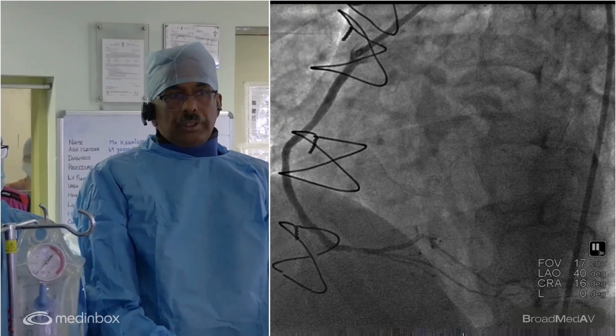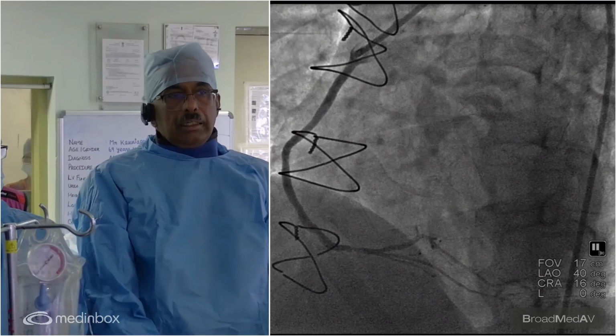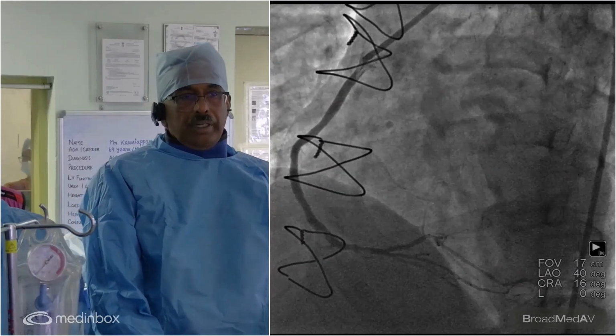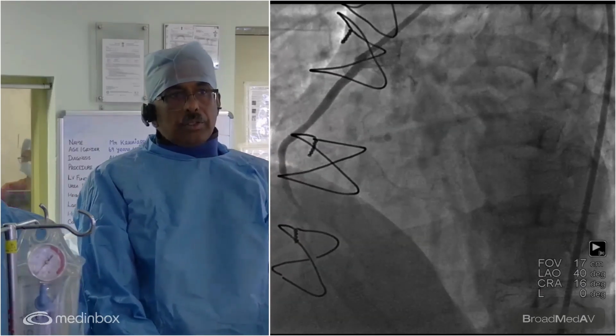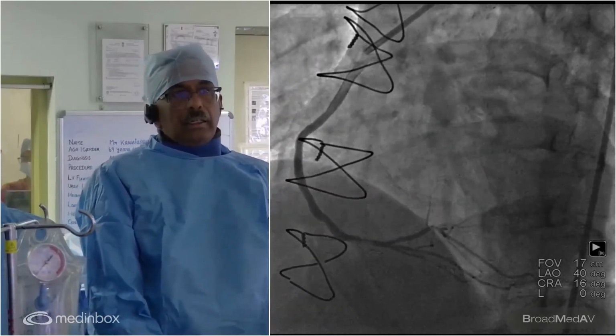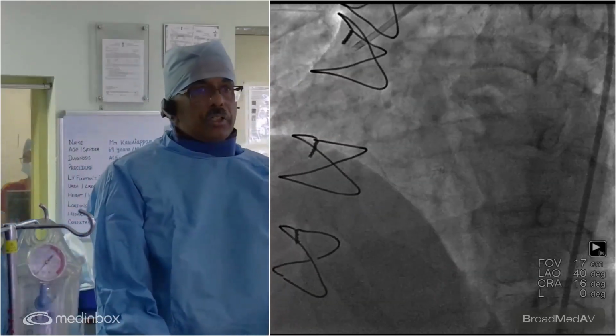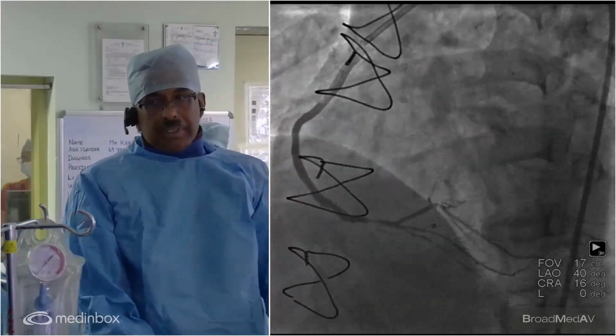The circumflex goes well on the native. The LIMA to LAD is normal. And the problem for his angina and his troponin rise seems to be the stenosis in the distal RCA vein graft. So let's play the angiogram from the morning. You can see here, this is the vein graft to the RCA. We have a 7 French sheath in, we have a 7 French guiding catheter in, and this is a multi-purpose guiding catheter.